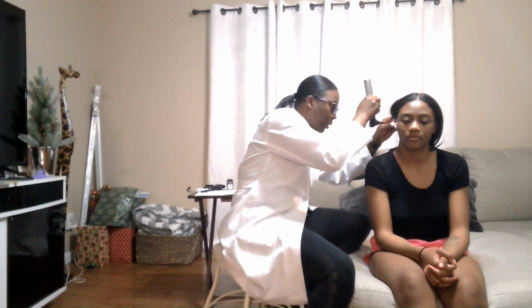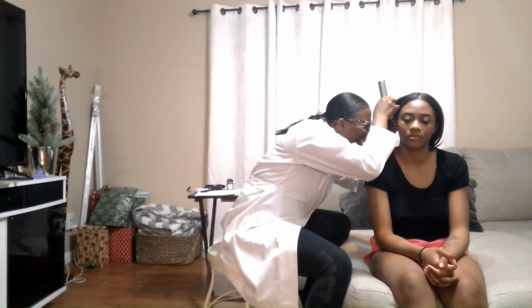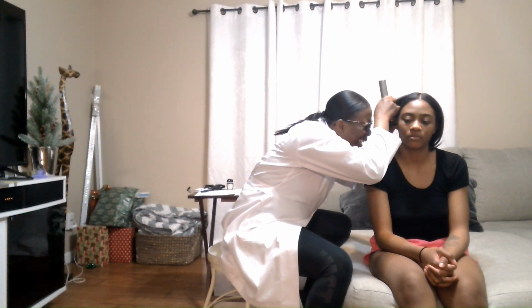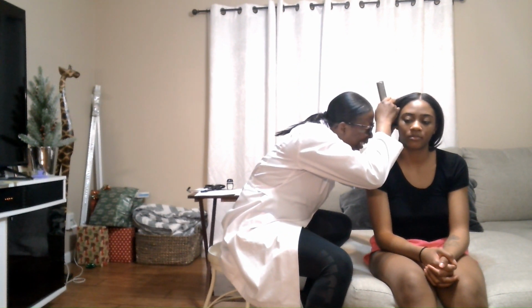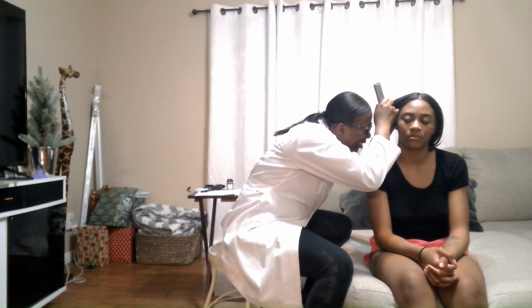Now I'm going to use my otoscope to look inside your ear. I'm going to pull your ear up and back to look inside. When I look inside, I'm making sure I don't see any foreign objects, any excessive amount of wax. And I'm visualizing your tympanic membrane, and it looks normal, a clear, pale white color. Any ear pain? No. Okay, and I'm going to check your other ear.